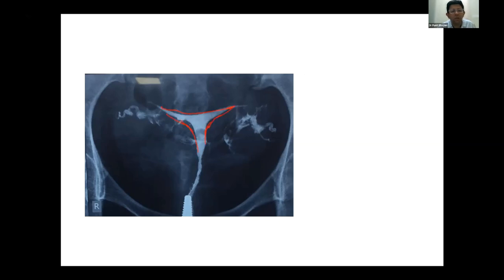It could be because of adhesions, tuberculosis, or even just a variation in the shape. And what is the T-shaped uterus known to cause? Anybody? Which kind of problem is it known to cause? We can have lots of complications, abortions, miscarriage, preterm, infertility. Yes, RPL, very good, Shreya. It is known to cause recurrent abortions. But of course, all T-shaped uteri you don't operate. If there is a history of it, then you definitely need to do a hysteroscopic metroplasty.